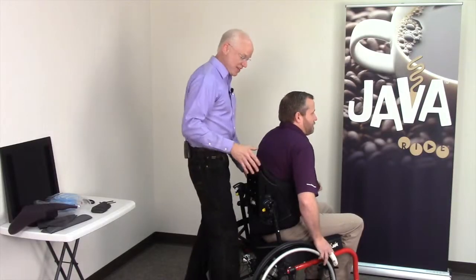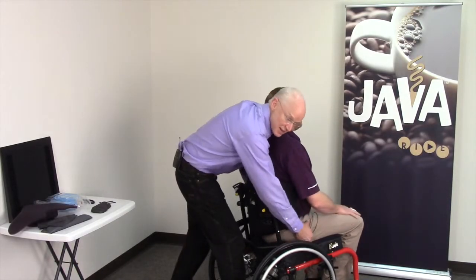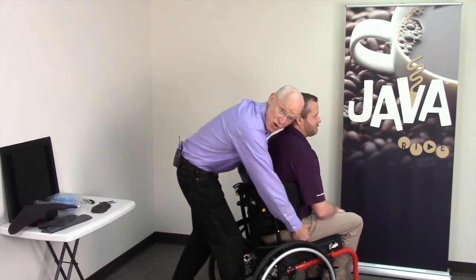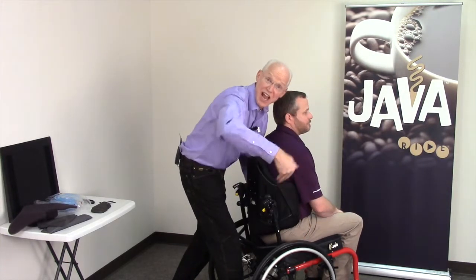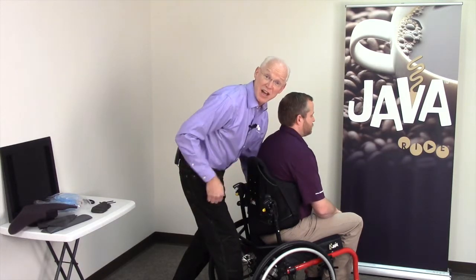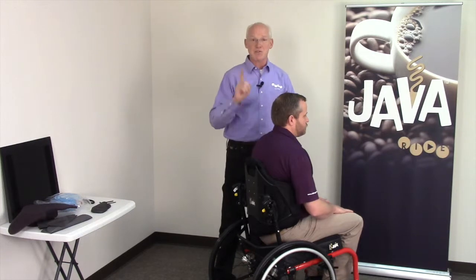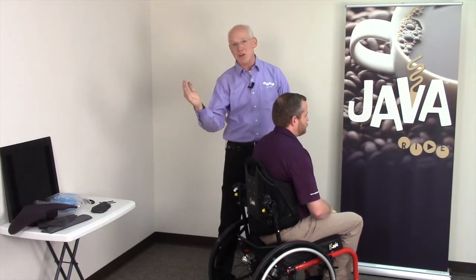And boy, he gets in there and right away he's telling me he can't sit up because he's falling forward maybe, and I'm feeling his trochanters, and his trochanters are not resting in that groove. He's about 1.5 inches too far forward. So here's the mechanism I'd use. First of all, I need to get him back on the cushion, right?